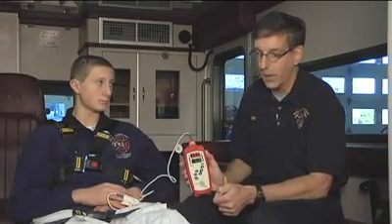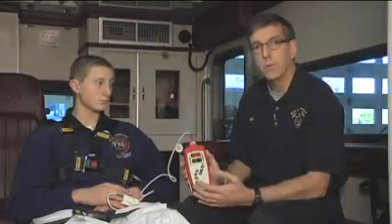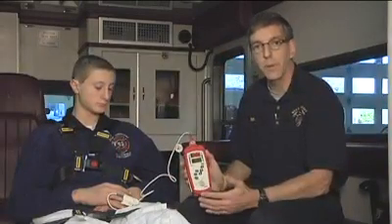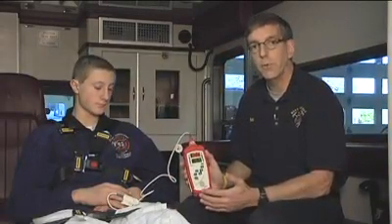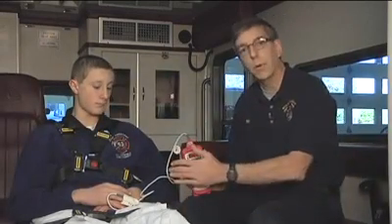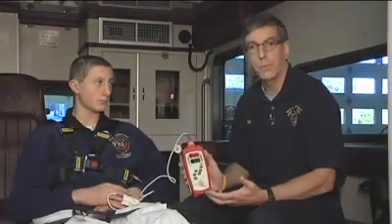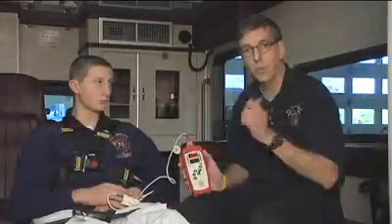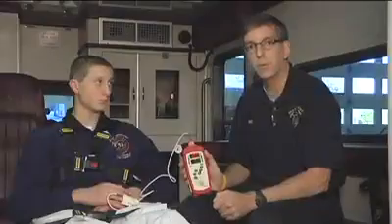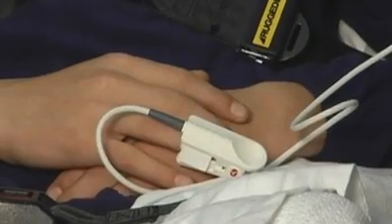The next question is the strength of blood flow to the digit where you place the probe. We chose the ring finger for the best blood flow, but if we weren't getting a good signal due to low perfusion, we may need to place the probe on another digit or perhaps on a toe. There are probes specially made for the ear, the nose, and the forehead. You need to use a probe designed for whatever application you're using — in this case, a finger probe on a finger.